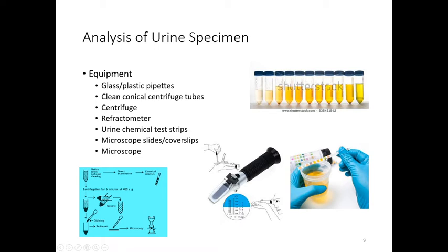Sometimes it will show white cells when there actually aren't white cells, and so I don't believe that completely. Sometimes that shows white cells when there aren't, because it's had too much light coming to it. So we kind of take those things, mark it down, and then look at the other parts and put the whole picture together.